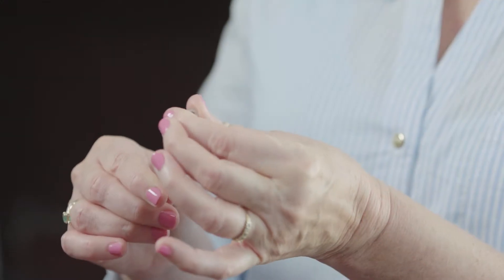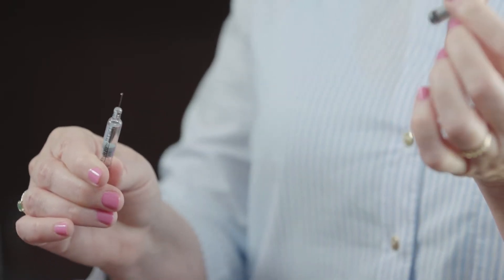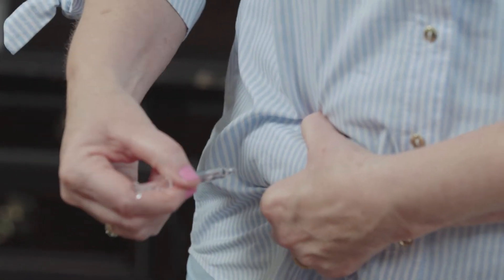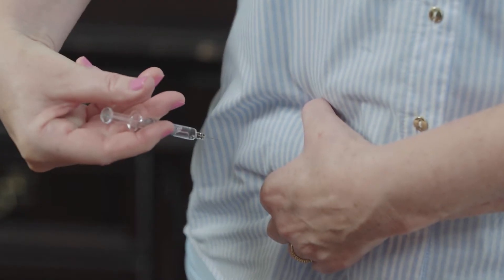You will take your syringe, which as I said was pre-filled with the dose the doctor wants you to take. You will uncap the needle and then you're just going to pinch the tissue. Push the needle all the way in so it goes to the hub. Push on the plunger to inject the medication.